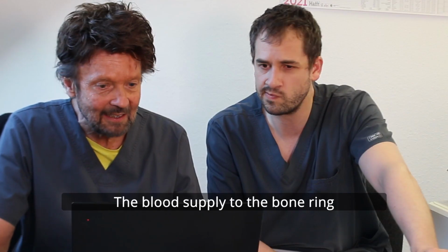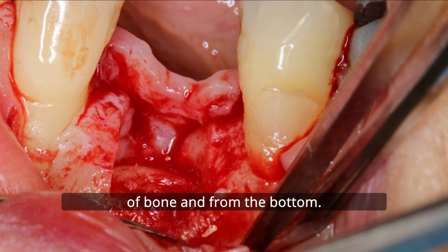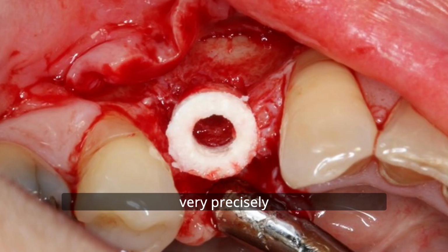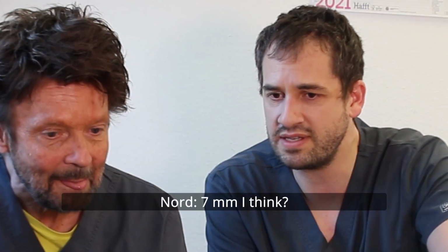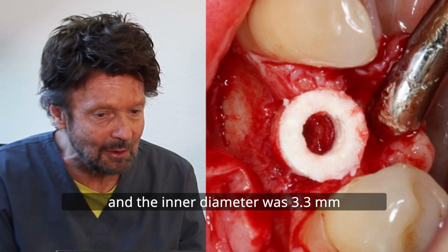The blood supply to the bone ring now comes from the distal and the mesial part of the bone and from the bottom. And you see, the ring fits very well, very precisely. This is very important for the blood supply, for the revascularization. That's an allograft ring here? It's an allograft ring, yes. And 7 millimeters, I think. 7 millimeter diameter, and the inner diameter was 3.3 millimeter.